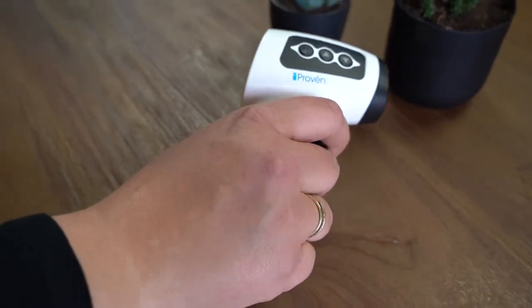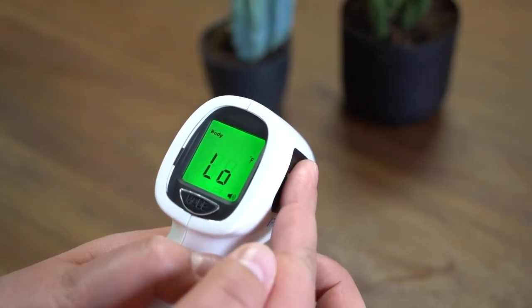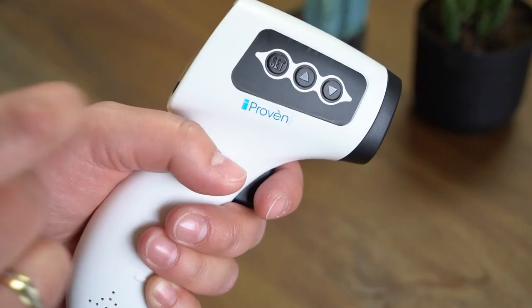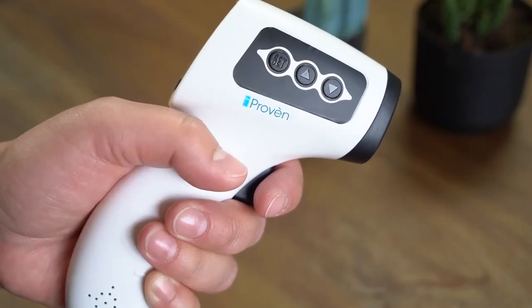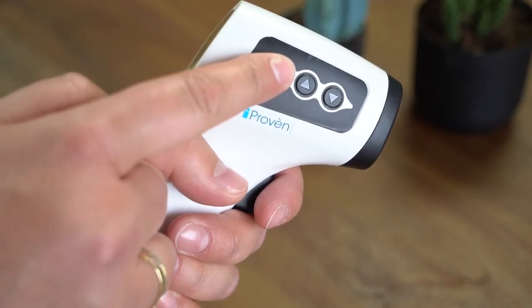Switch between Fahrenheit and Celsius by entering menu setting F1. Press the set button, then navigate between Fahrenheit and Celsius using the up or down buttons. Press set again to confirm your choice.